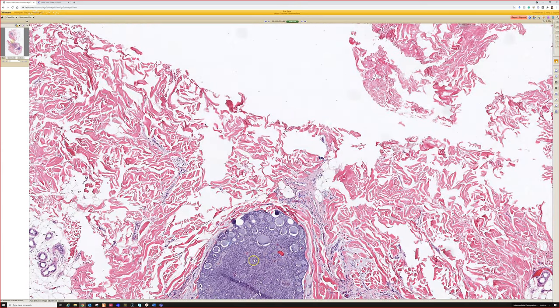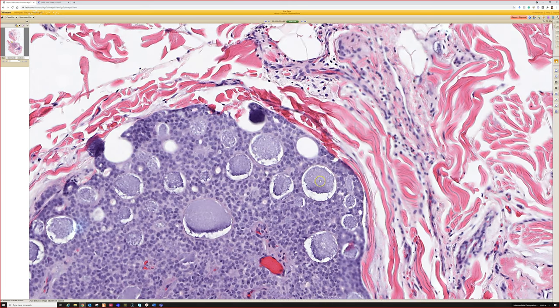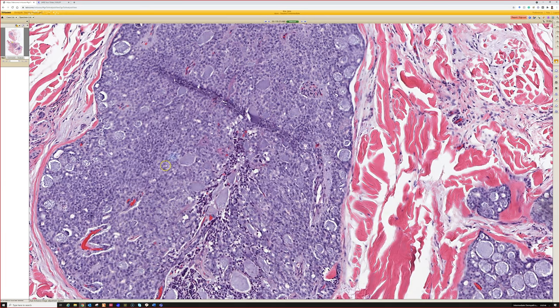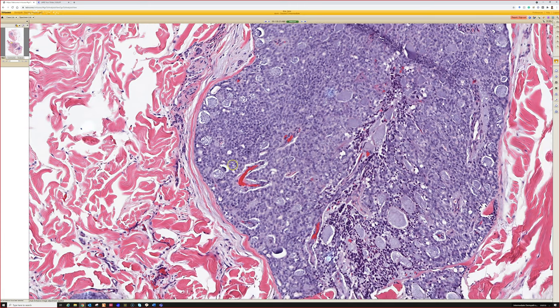Another difference from basal cell carcinoma is this, that the blue spaces, they almost have like a little thin pink layer, like a cuticle, a little thin lining of dense pink around, and that's what gives them, I think, this very sharp, punched out look. And then they've got mucin in the middle. And in basal cell, that's just basically mucin, like pulling apart the tumor and making these kind of pools. So that's this very discrete little layer of pink there with the mucin in the middle. Helps. And then also, again, if you look around, you're not going to see the other things that we'd see in basal cell, like the nice basal palisading, the mucin-filled clefts and stuff like that.